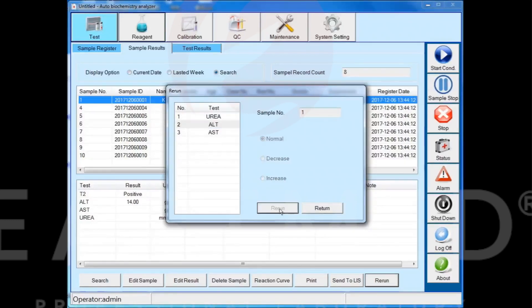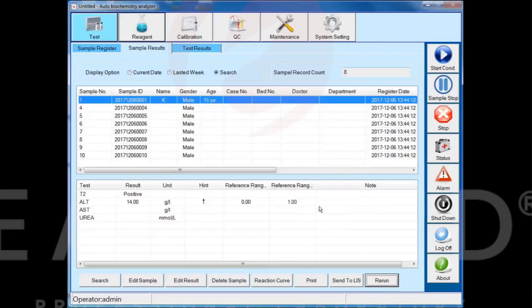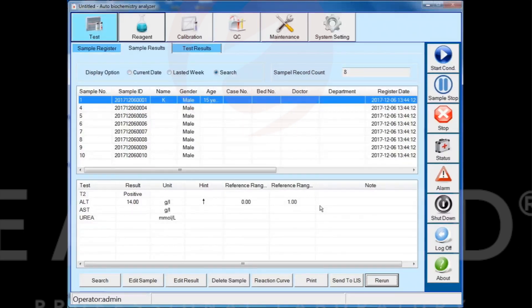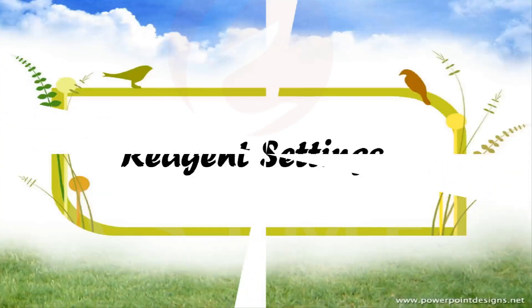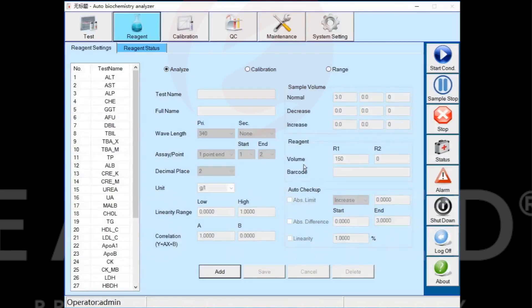Fourth part: Reagent Configuration. According to the contents of the reagent menu, add or modify the parameters of the test items on the Analyze page.